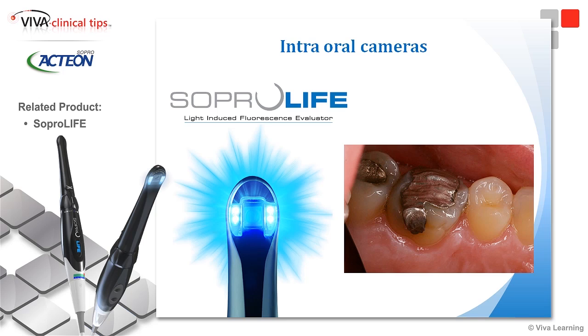I use that whenever I find a fracture in a tooth because I want to be able to possibly go back and see it if maybe the symptoms didn't resolve or somewhere in the future the patient's complaining. I've got the image. I've also educated the patient through these intraoral camera images as to why we need treatment or what may be necessary further down the road.